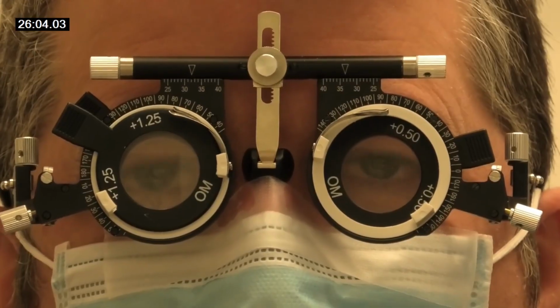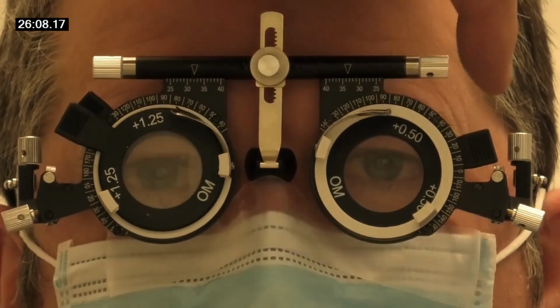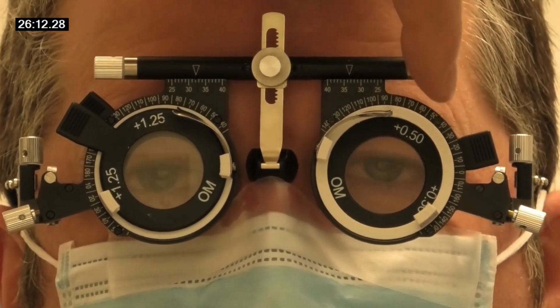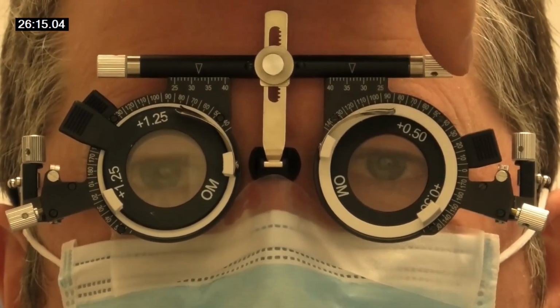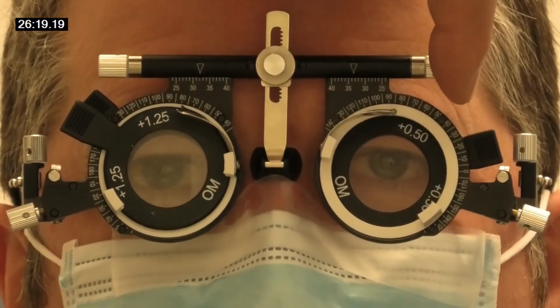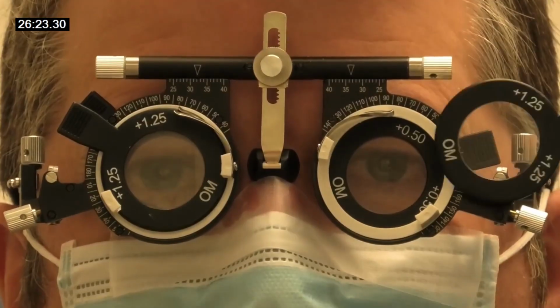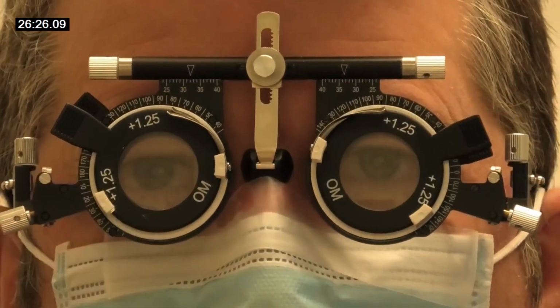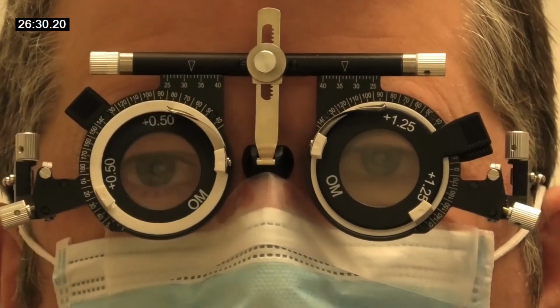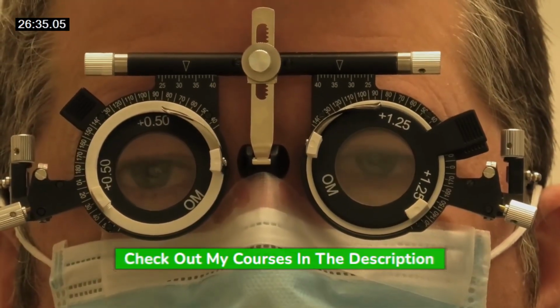That's right, so try and put that one back. No, because this is red. -0.25 will make it all green. We just did that last time. Yeah. No, so we need to blur this one up now. That's it, blur that one up. And then do that one now. What about now? That's the red. Red. Yeah, so that's the same, isn't it?